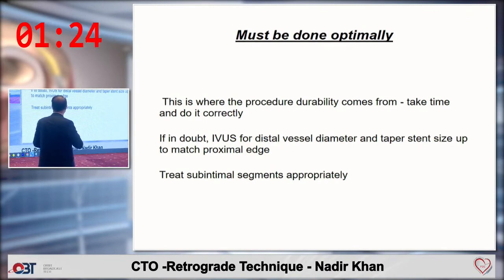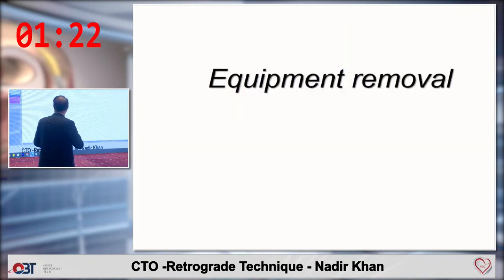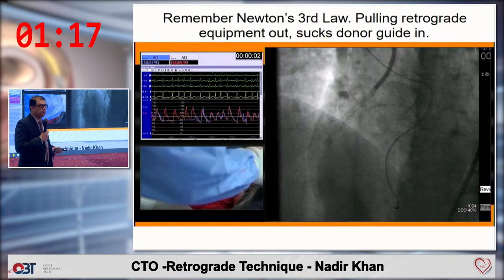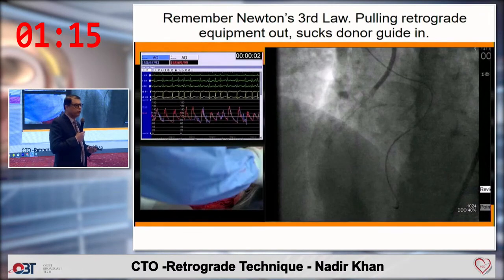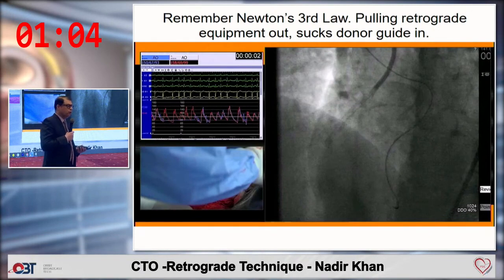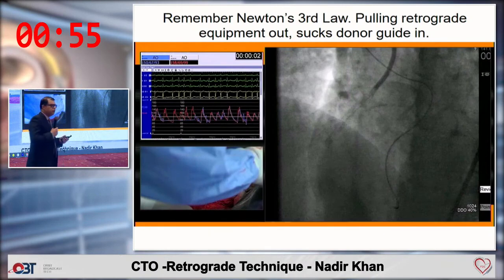And again, bad things happen when you are removing the equipment. So be very careful, and whenever you are pulling the retrograde equipment, the donor guide gets sucked in, and it can cause dissections and problems. So always disengage your guide whenever you are pulling back the equipment, and remember that bad things happen when you are pulling on the equipment.